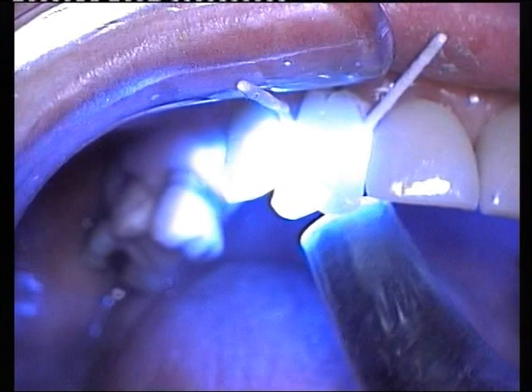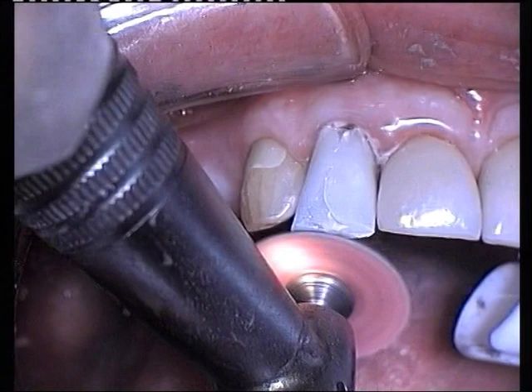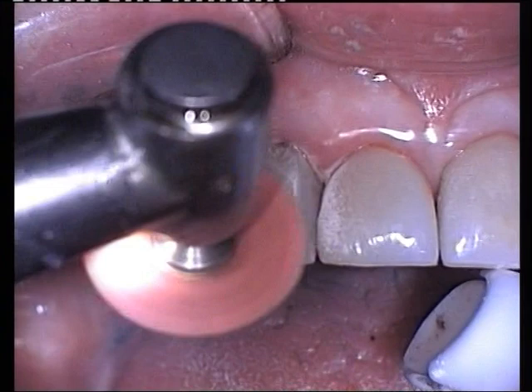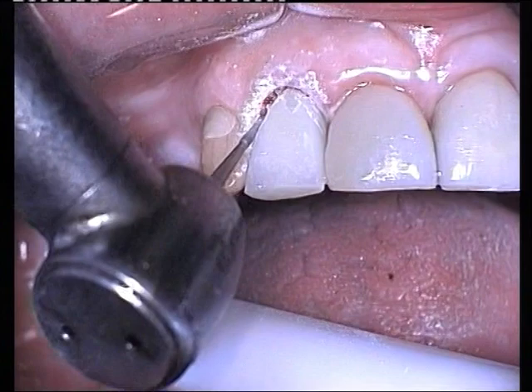After removal of the paper points, finishing of the crown can be commenced, initially with course extra-coarse emery discs, commencing at the incisal edge and working over the labial surface. A high-speed pointed diamond is used to contour the cervical margins, followed by a slow-speed finishing diamond.